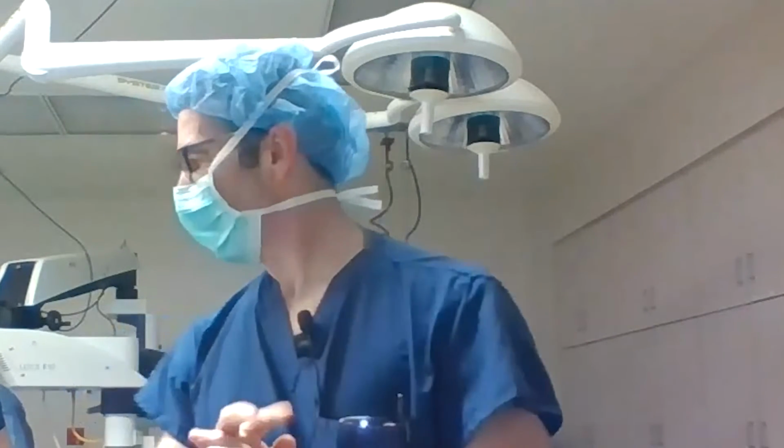But we did find the breaks, and you can use the clues about where it should be and look at those areas more closely. Again, it's usually on the higher side. The detachment was like this, higher on the temporal side, and the breaks are usually within the first 2 clock hours on the higher side. That's exactly where it matched up in this particular case.